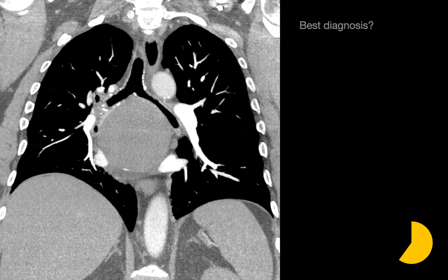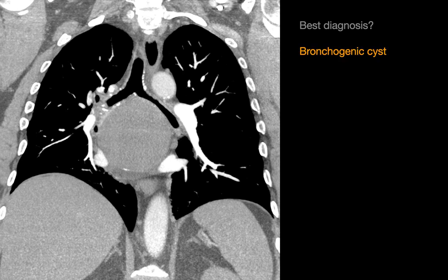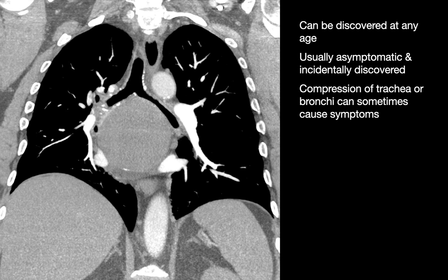In this patient, we might have observed splaying of the tracheal bifurcation on the frontal chest radiograph, and a relatively homogeneous density in the subcarinal region on the same chest radiograph. On this coronal CT image, we recognize a rather large, round, well-circumscribed mass in the subcarinal region that is isoattenuating to soft tissue. The best diagnosis in this case is a bronchogenic cyst. Bronchogenic cysts can be discovered at any age, and they're usually asymptomatic and an incidental discovery. However, with larger bronchogenic cysts, mass effect can result upon the trachea or bronchi, potentially leading to symptoms.